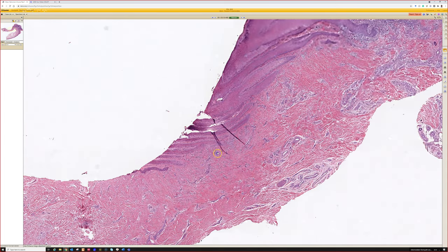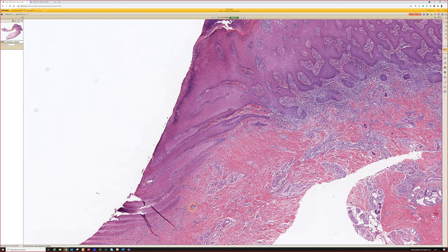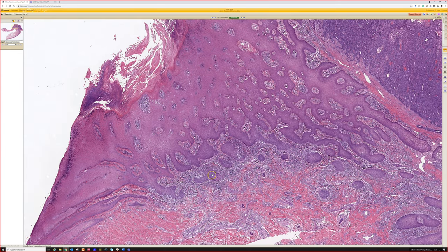So, and then also over here, the other thing is nail bed epithelium. This is not normal because it's distorted. Look how tangential that cut is. See all those islands of papillary dermis? We're cutting totally across at a very oblique angle. That's why it looks so wild here. We're seeing all the interconnections of the rete.